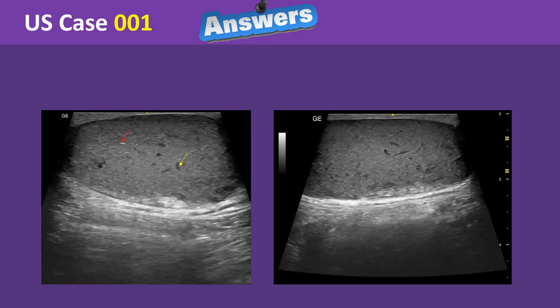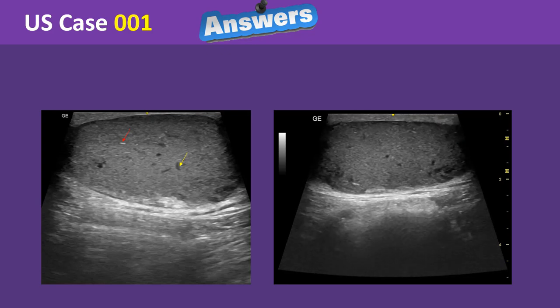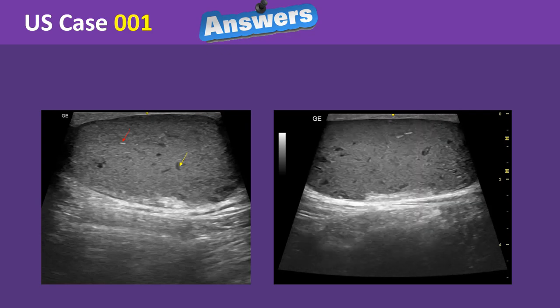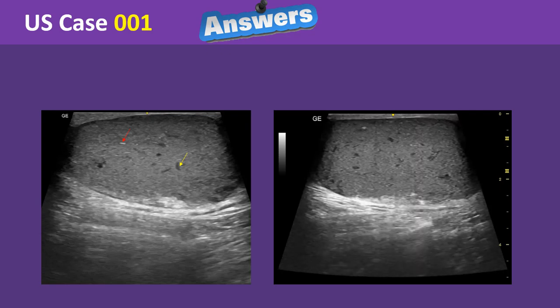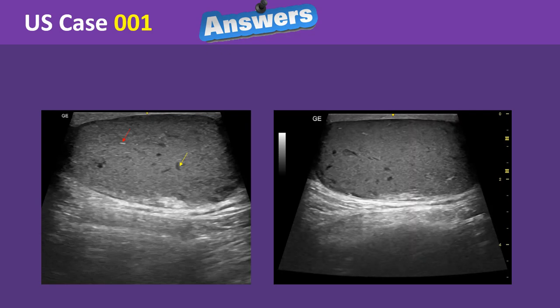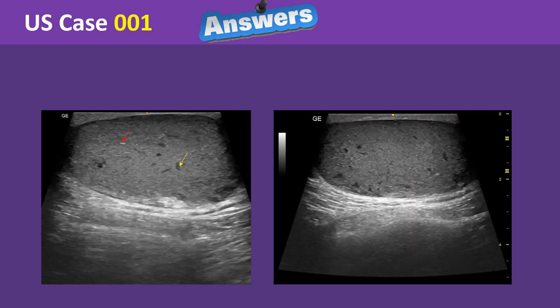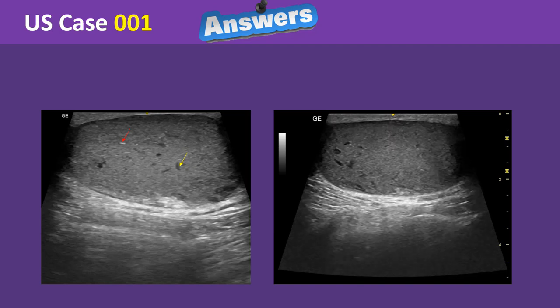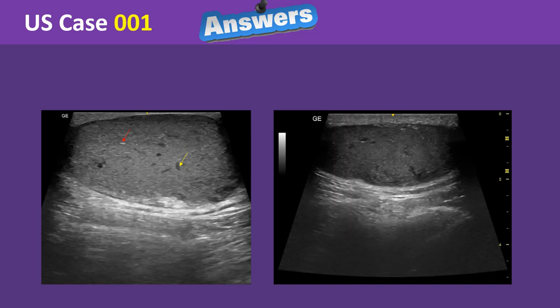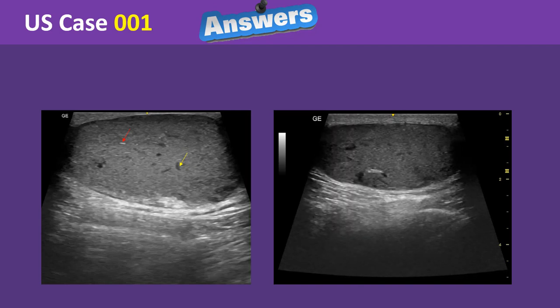There is no significant intralesional or perilesional vascularity on color Doppler imaging. No surrounding collections. The overlying skin and underlying muscular planes appear unremarkable.